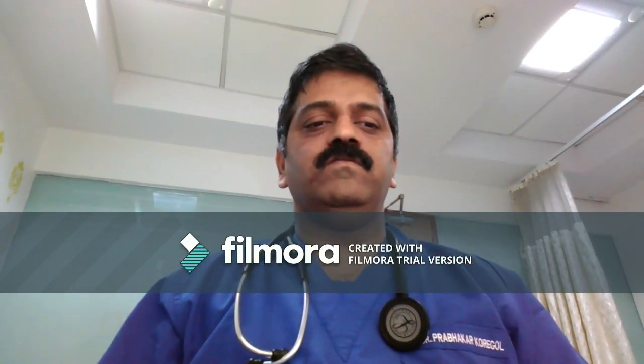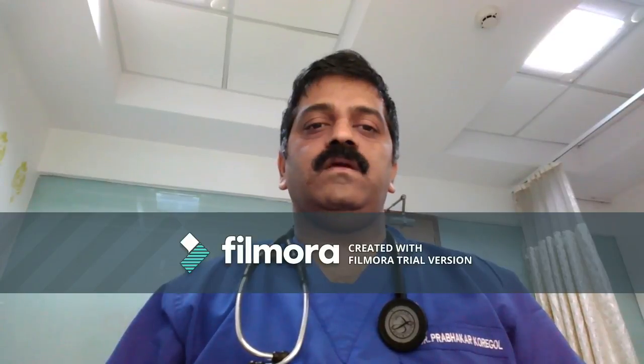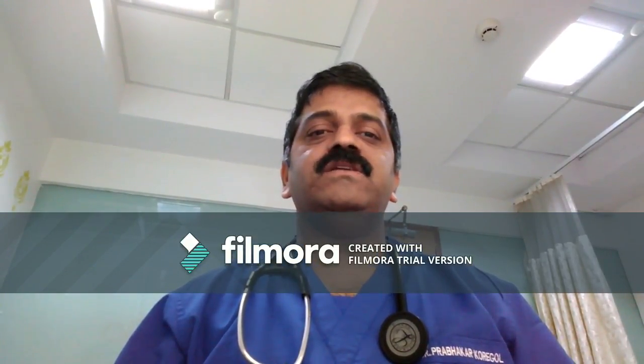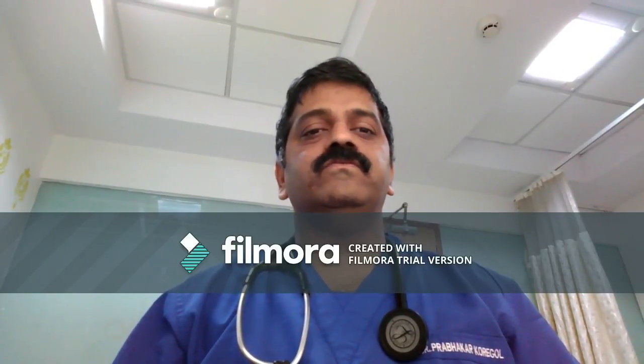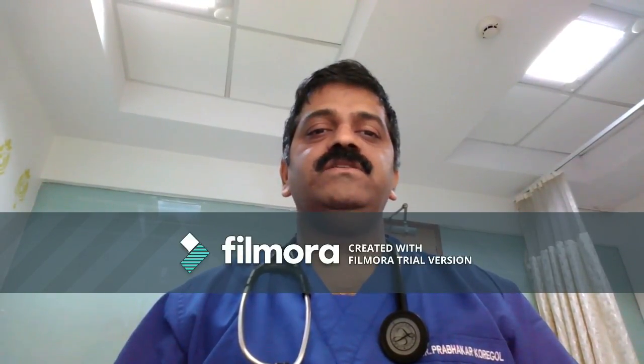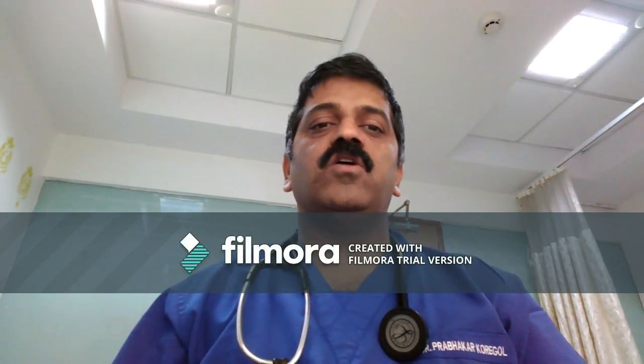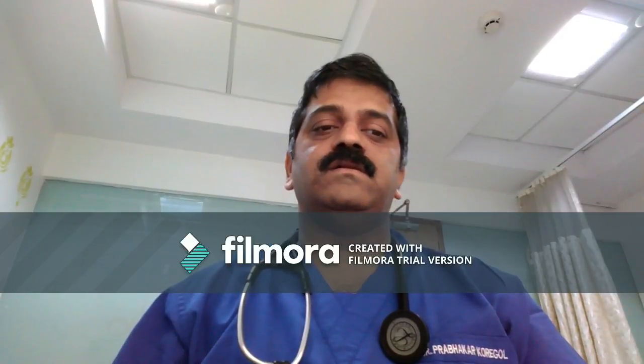Then when we talk about the infarction, we look at the ST elevation. To characterize more, we talk about ST elevations 80 milliseconds after the J point, and then the ST elevations that are convex upwards.